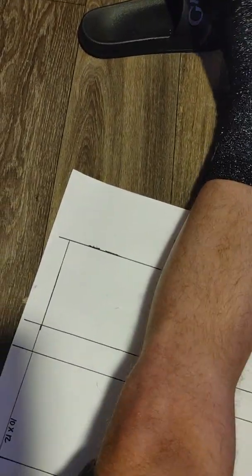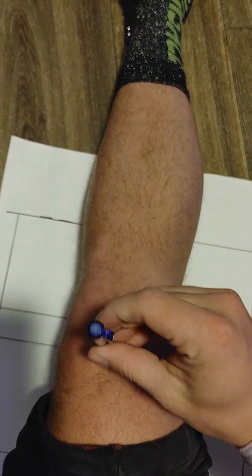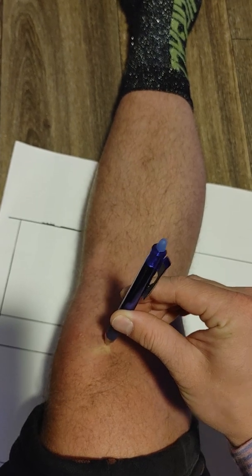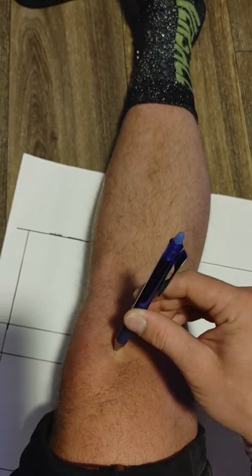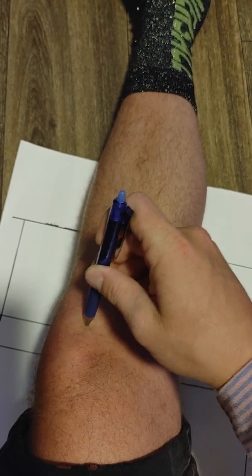Next, we have the lateral oblique view of the knee. It'll be the same idea as the other two, because we're seated or recumbent. We're going to have the central ray at a 3 to 5 degree tilt, down, pointed directly into the joint space here, which is about a half inch below the patellar apex.